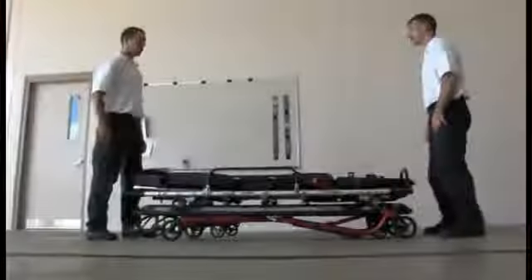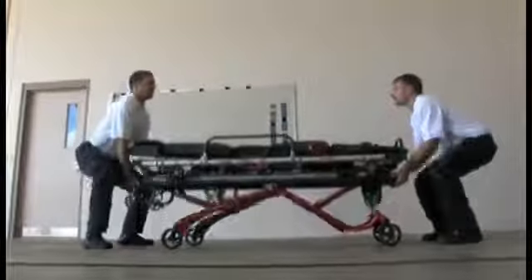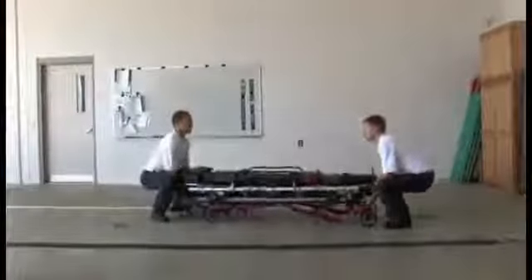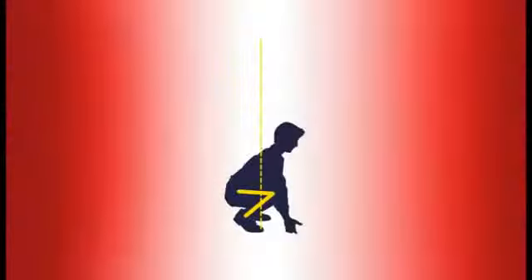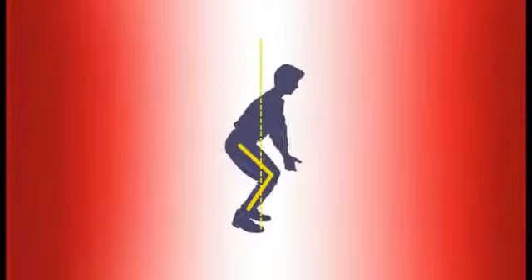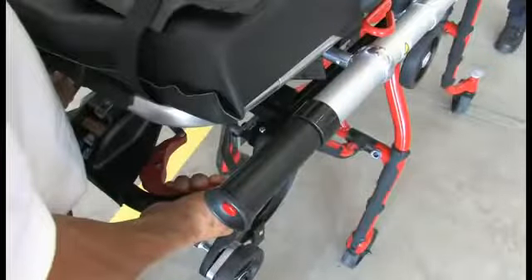Raise and lower the cot. The Mondial ensures operators maintain the best lifting posture when raising and lowering the cot by using the Easy Pull Release handle. Proper lifting posture means lifting with your legs while keeping your back straight. To lower the cot, pull the red Easy Pull Release handle at the rear of the cot.